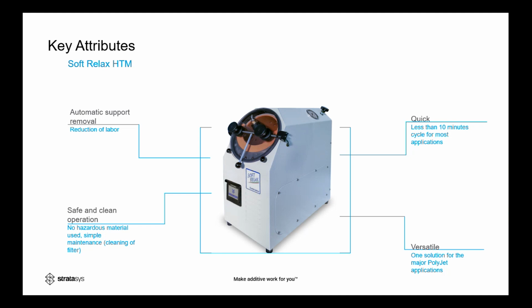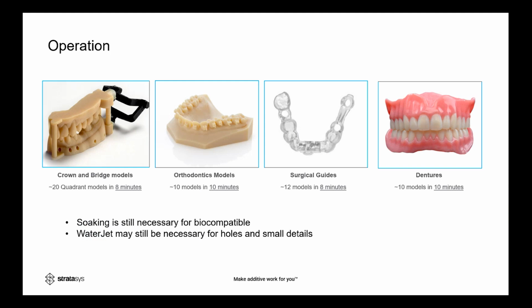If you have any questions about it, feel free to respond in an email. We can offer you some guidance or give you the best practices with those. Just in a nutshell, it takes about 8 minutes to do your bridge models, 10 for your ortho models, your surgical guides in 8 minutes, and your dentures in about 10 minutes. And obviously, this is dependent on the temperature of the water.